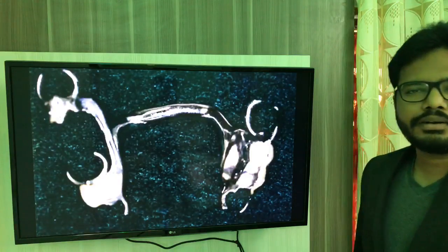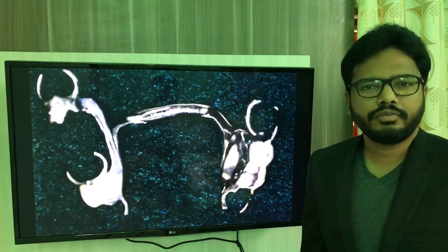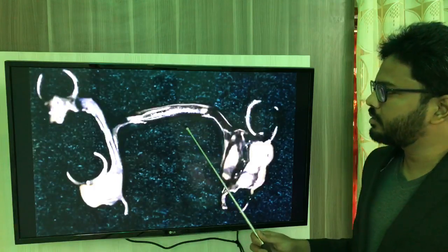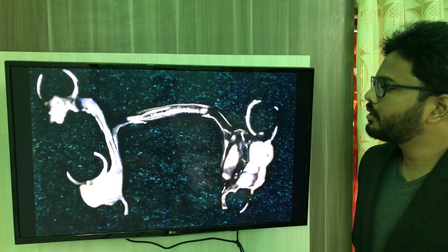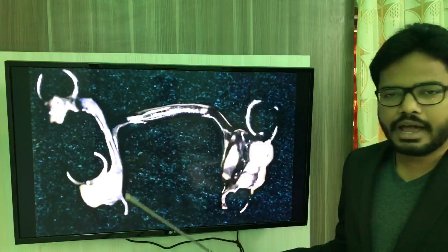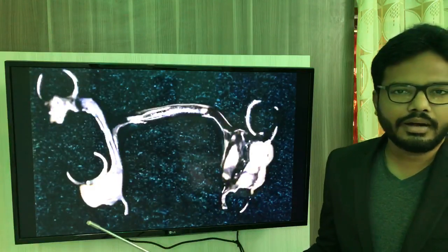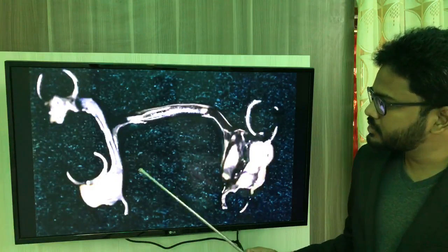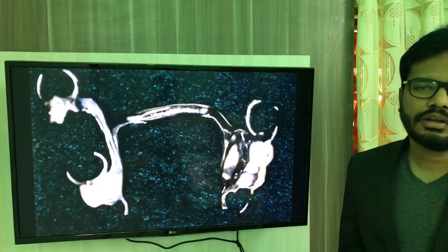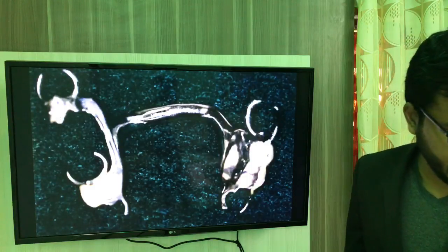So single palatal bar, the cross section is half oval shape, and we have various drawbacks, like for example, it doesn't have this stiffness comparatively, right? So single palatal bar, which is extending across the palate, and with a cross section which is similar to that of half oval, right? So this is a single palatal bar.